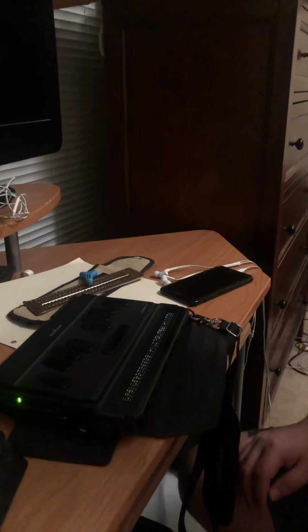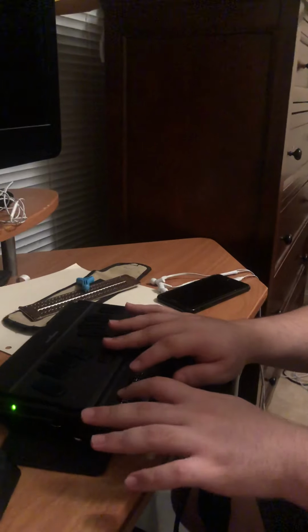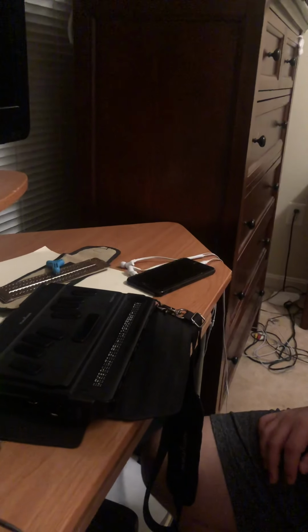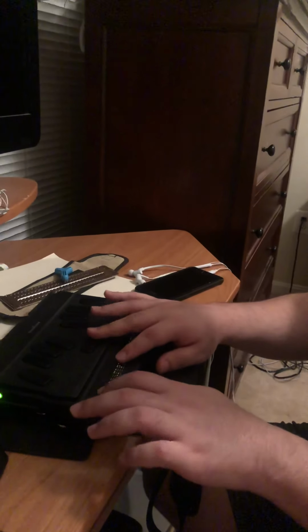Word processor is where I write up my documents or read documents that I receive. Planner. Planner is a calendar. File manager. File manager is where my files are stored, like PDFs, maybe even Word documents, any file that you can think of, the file manager has it here.